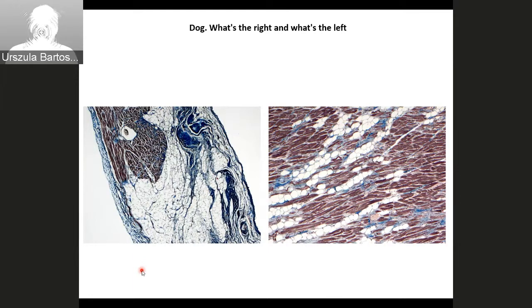I've noticed this. Maybe I'm wrong. I just have in my head that it was something going from one direction to the other, like starting from epicardium to endocardium, or the opposite. I can't remember.